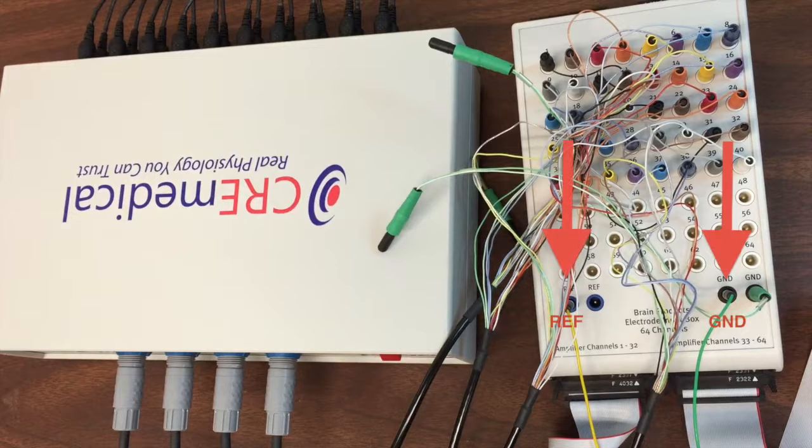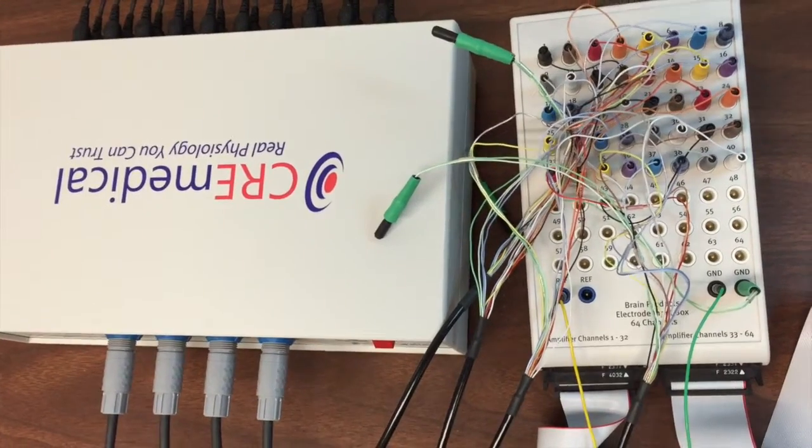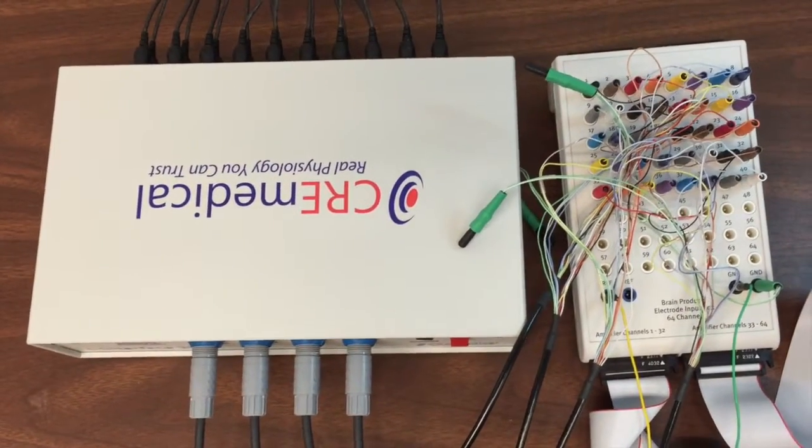Note that you still need to plug in conventional disc electrodes to both amplifier ground and reference as in conventional eEEG recordings. If your amplifier only has one isolated ground connection, you will need to use a jumper in order to plug in both the T-interface green wire and the ground disc electrode. Prepare and place the ground and reference disc electrodes as you normally would. This completes the setup of 20 T leads in the T-interface 20.